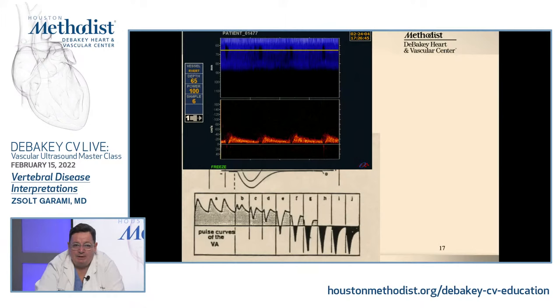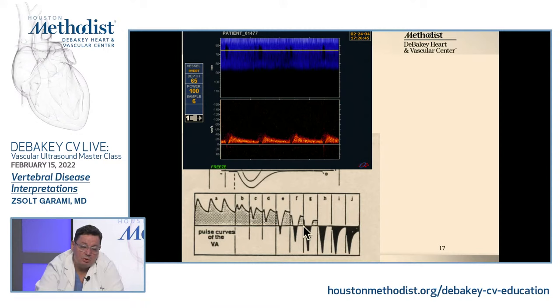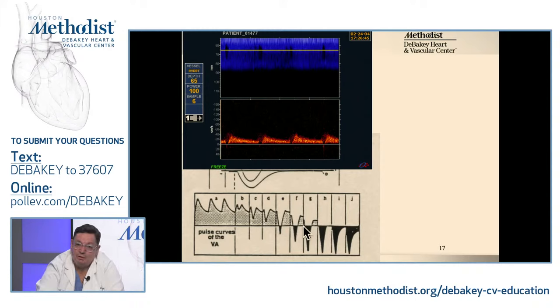From a pediatric journal I found a beautiful illustration: from a normal antegrade vertebral artery with just a V-shaped cut-out in systole, all the way to the retrograde vertebral — these are different stages depending on how severe the proximal stenosis is. The vertebral waveform changes accordingly. If blood pressure is equal bilaterally, it's not subclavian disease; if blood pressure differs, the subclavian disease is causing the abnormal vertebral waveform — that's how we approach it.